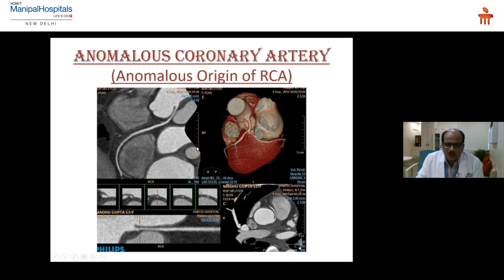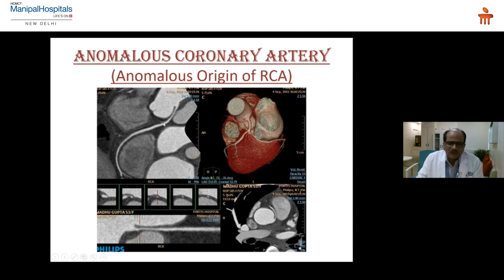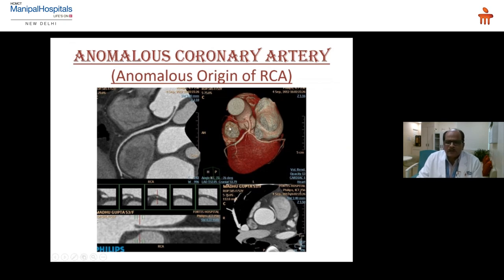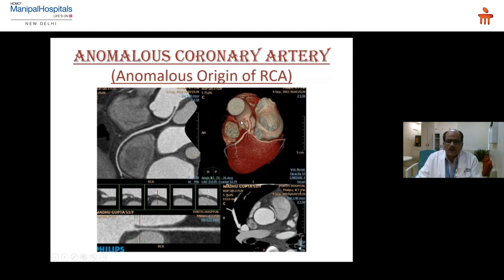Another very interesting case: a young lady, a paramedical staff member, had breathlessness on exertion and was placed on medication for a long time. CT was done and the findings showed the RCA arising from the left main with a course between the aorta and the pulmonary artery — between two high-pressure chambers. So on any exertion, this artery gets compressed, causing chest pain and dyspnea. This is known as the malignant form of anomalous RCA.